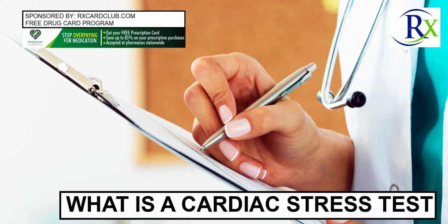Follow-up. If the results of the test are normal, negative, meaning that none of the diagnostic values are suggestive of CAD, you may require no further testing. If the results are abnormal, positive, meaning that there is evidence of CAD, your healthcare provider will want to speak with you about treatment options. Depending on what the tests say, further testing may be recommended, including a coronary angiogram to pinpoint the exact location of the blockage.